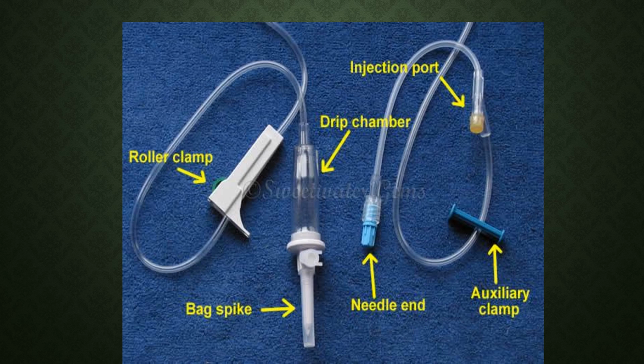In the 80s, every patient wasn't on a pump. You guys have the luxury of having all your patients getting IV pumps now, so everything's closely regulated in terms of flow. We didn't have that luxury. We used roller clamps most of the time. So you had to calculate the drip rate, calculate how many mLs you wanted to give per hour, and come up with a number. And I used to have most of the common numbers memorized.